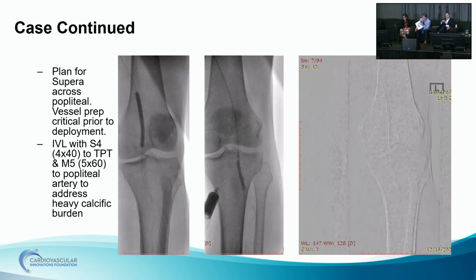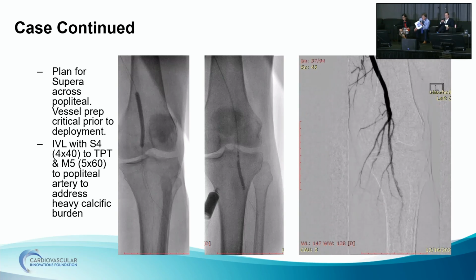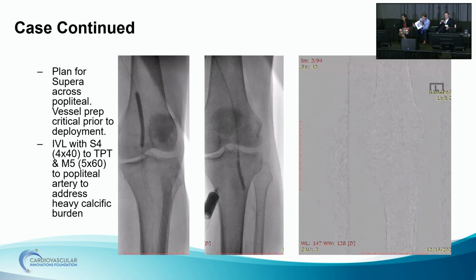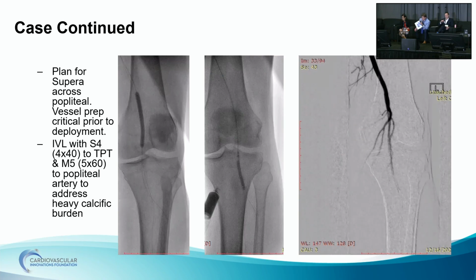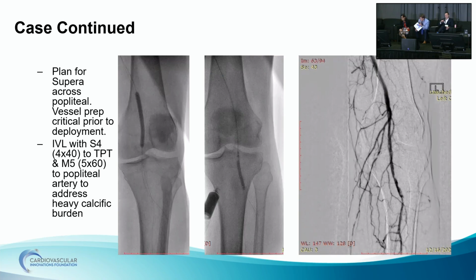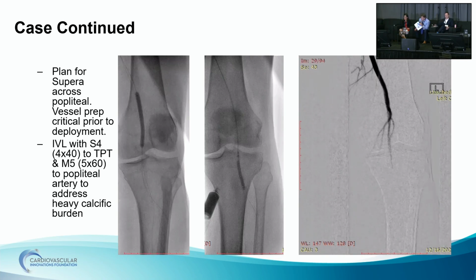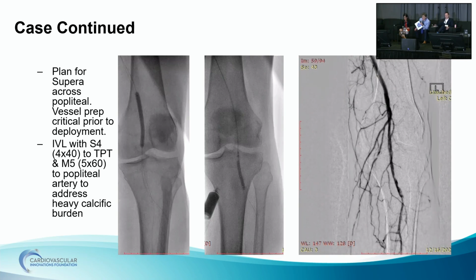And do you have a picture below that? I'm sorry to keep asking for angiograms, but yeah, it would help me put the pieces together, an oblique angiogram that includes a little bit more downstream, because it looks like the anterior tibial artery is gone. And that can only happen with a dissection or thrombus. That's where your IVUS is going to help you a lot.